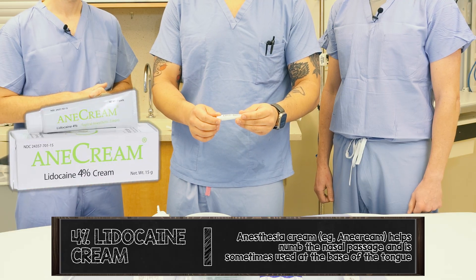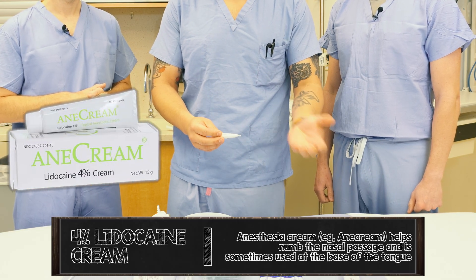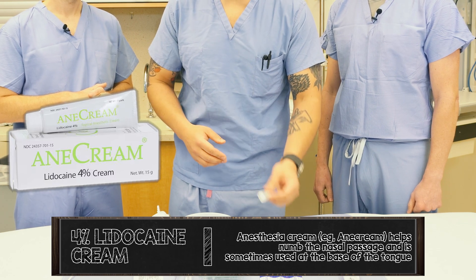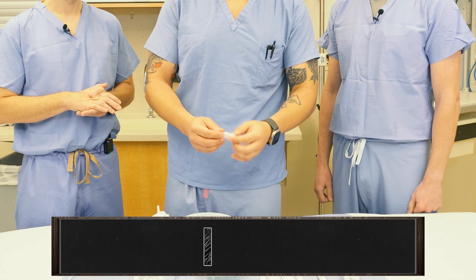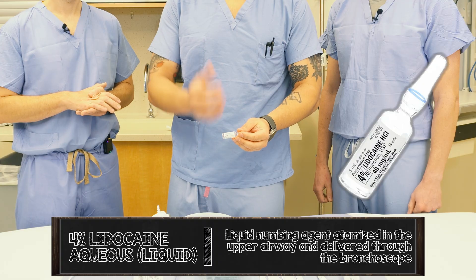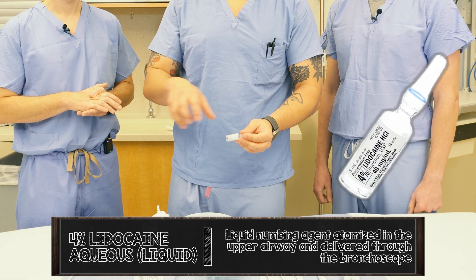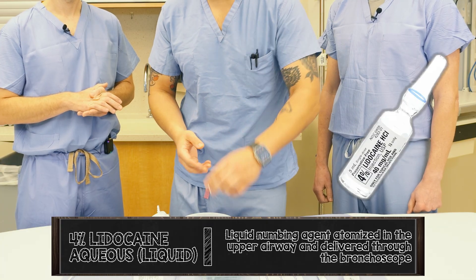Then we have 4% lidocaine cream, called anesthesia cream — Anecream for short — but you can use anything that's 4% and in cream form. The other anesthetic you'll want is 4% aqueous lidocaine. This is going to be applied to the back of the mouth as well as the epiglottis, arytenoids, vocal cords, and surrounding structures. This is really important to have as well.